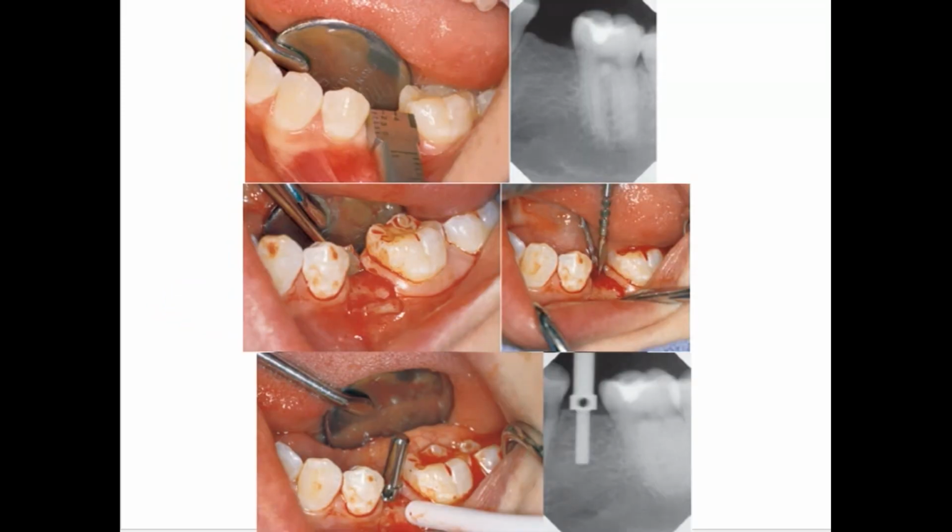Another advantage: a second surgical procedure and suture removal appointment are not necessary. This saves the patient discomfort and the surgeon 2 appointments. Also, the abutment to implant connection may be placed above the crest of bone in the one-stage surgery. This higher location of the implant abutment connection may reduce some of the early crestal bone loss in a developing implant interface.